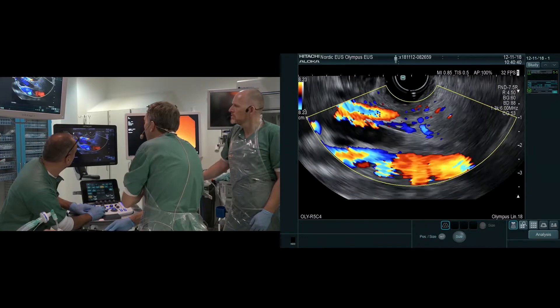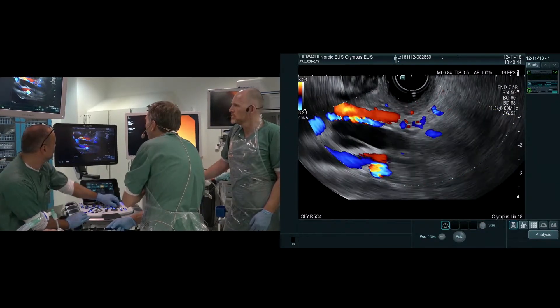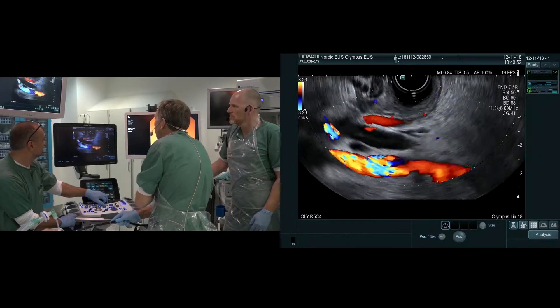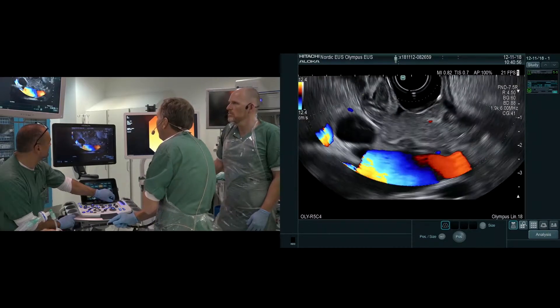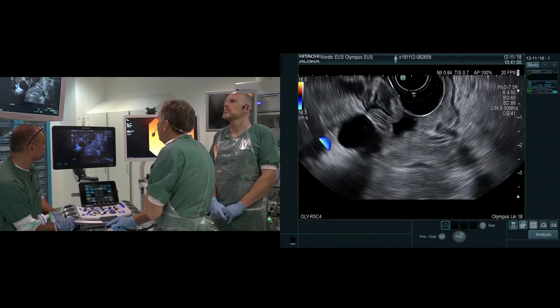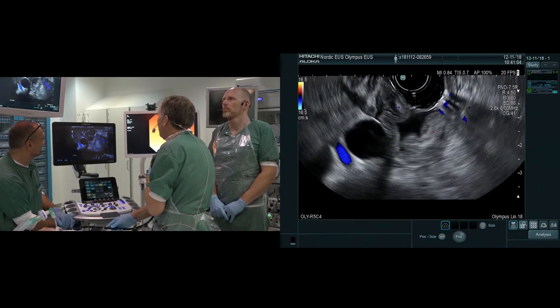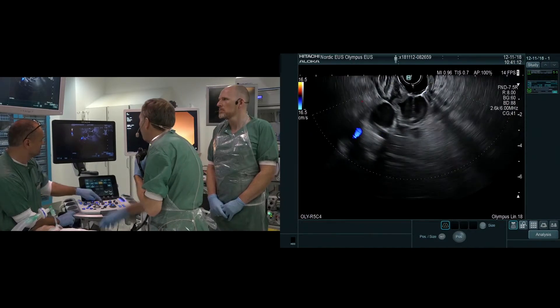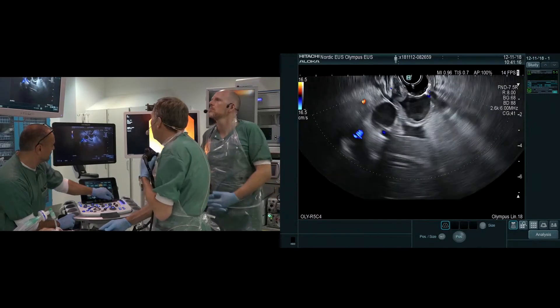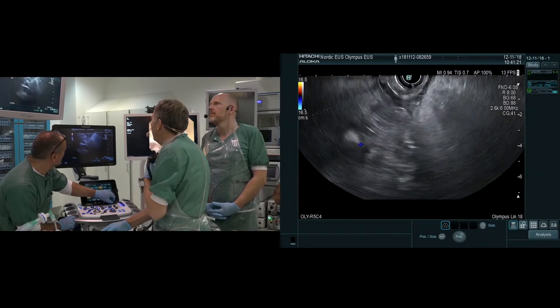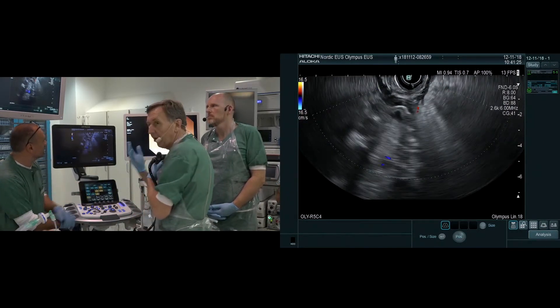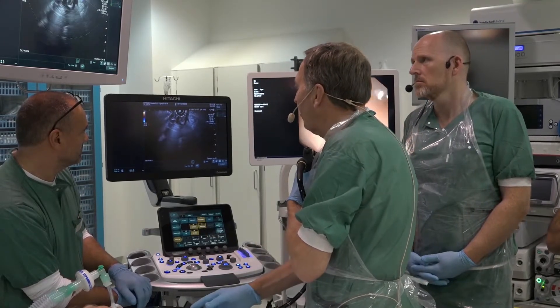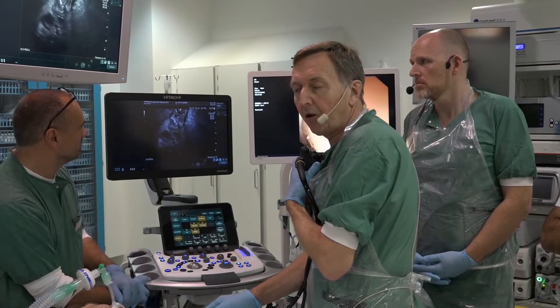I enlarge the window a little bit. You see the common bile duct has no flow inside. I can now follow the complete common bile duct backwards by rotating to the left side — it gets bigger and bigger. This is a cross-section now, and we are coming to the level of the liver hilum. So, we can say the common bile duct is dilated, but we have no reason for it — no bile duct stone, no tumor. There is a little bit of heterogeneous pancreas but no major criteria for chronic pancreatitis.